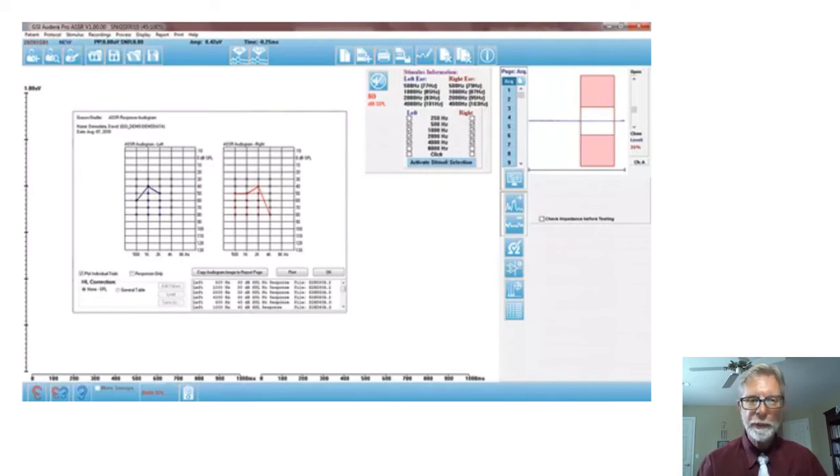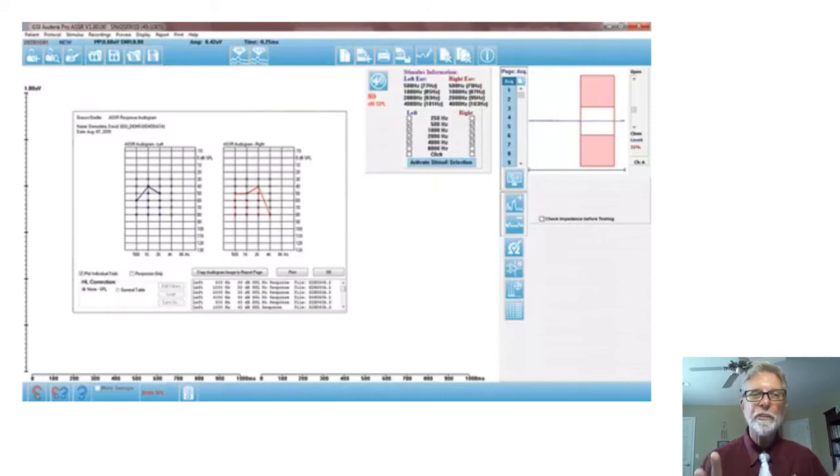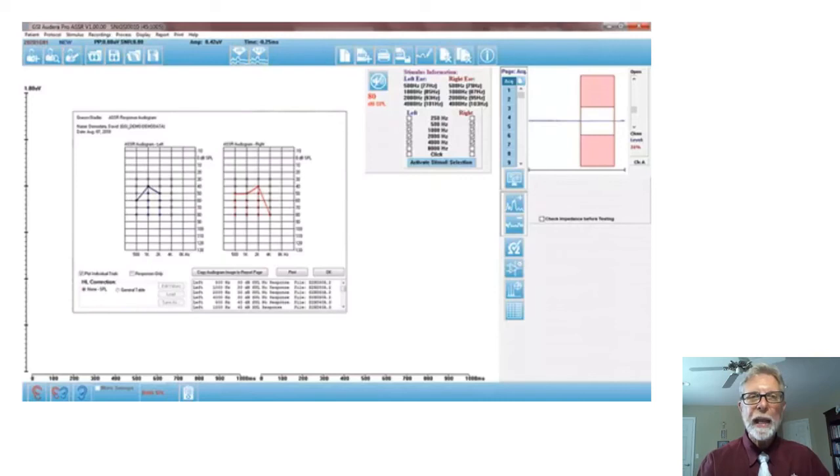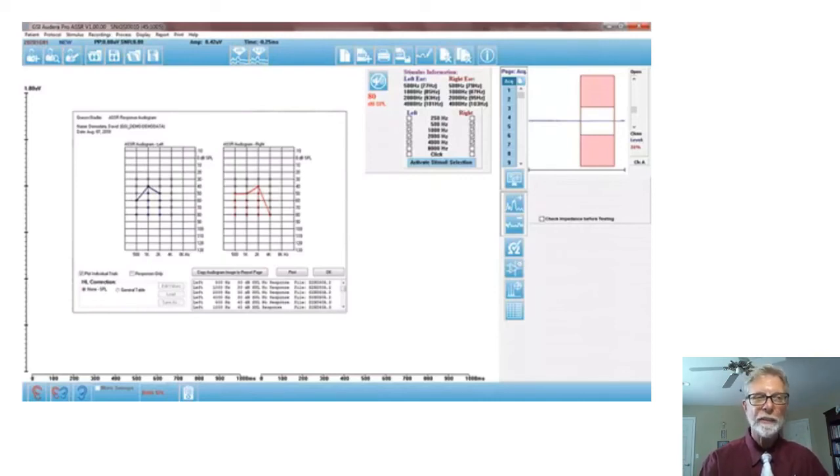And of course, it's completely automated, but you have the power to change any of the, any of the protocol that you want to. So it's flexible and practical at the same time.